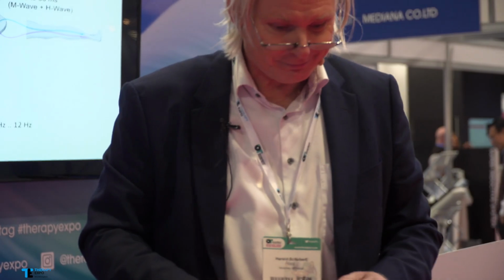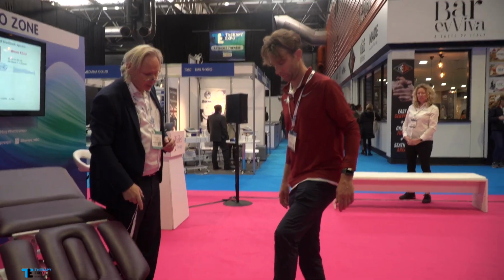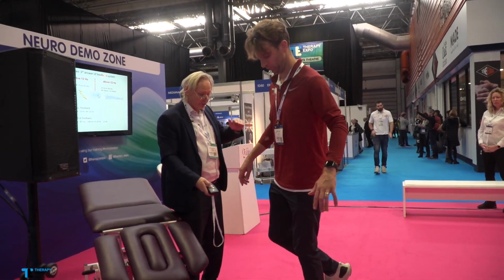I show you now the difference between the spinal feedback system and the central feedback system. Who wants to do a one-leg stand on the Galileo? Balance, one-leg stand. Come, yeah. Go on the zero with 1 foot and try to balance. So I start now with 18 hertz.